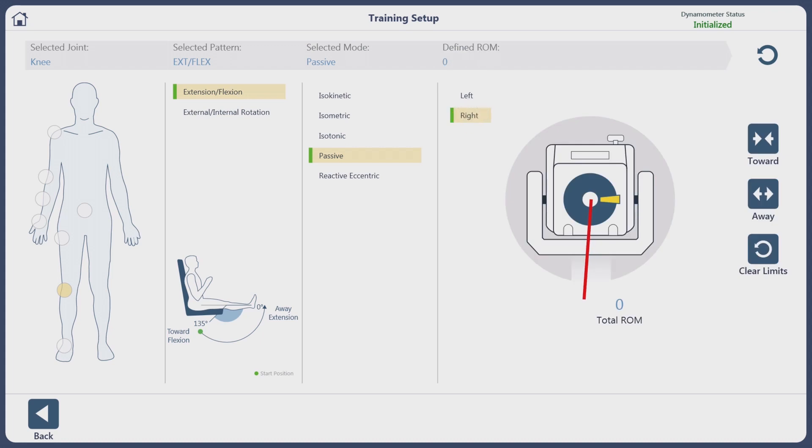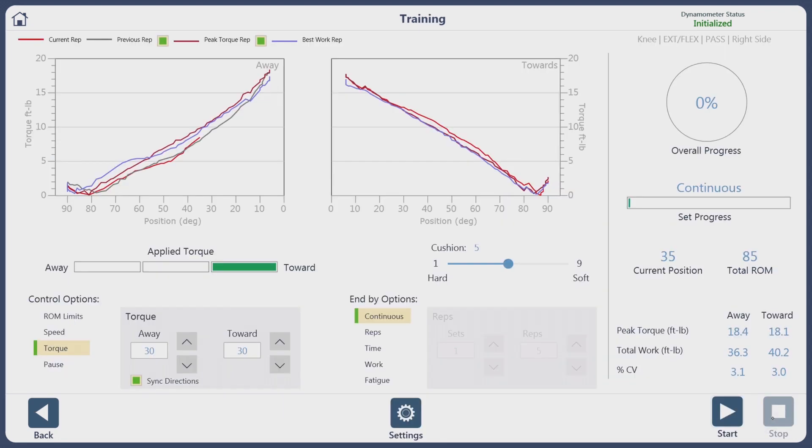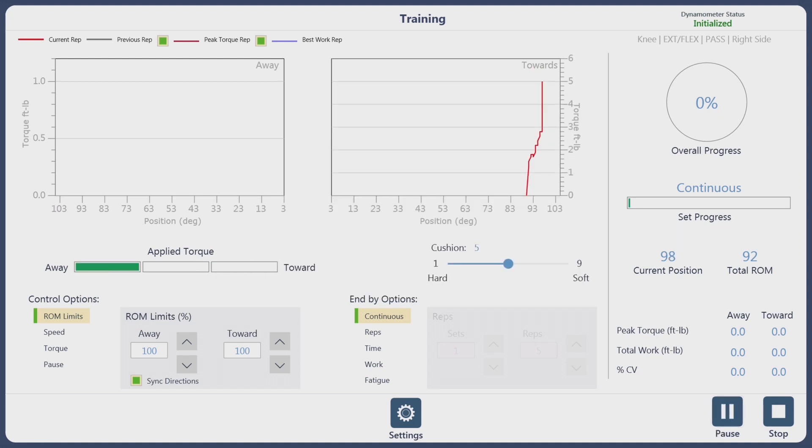We're going to set the range of motion — toward the body will be flexion and away from the body will be extension. We then calibrate our goniometer to the specific point where the patient is. We'll bring them to about 90 degrees, calibrate the goniometer there, hit Next, and hit Start. Inform the patient we're going to run a passive range of motion, and you're up and running in the training screen.